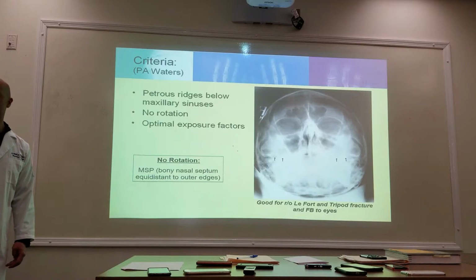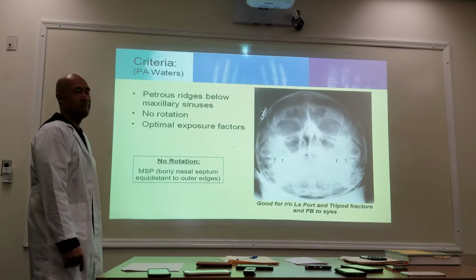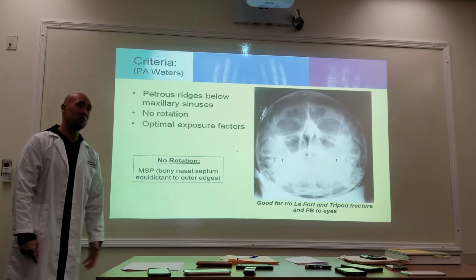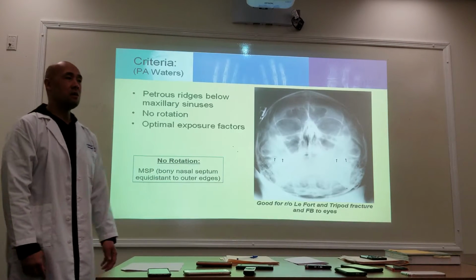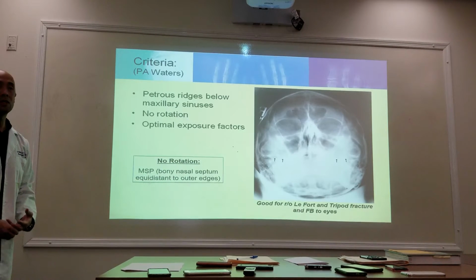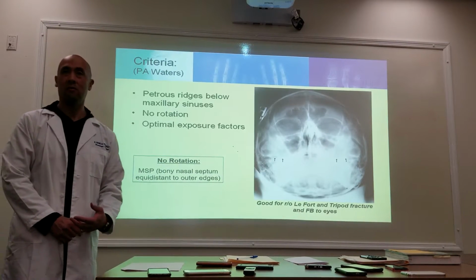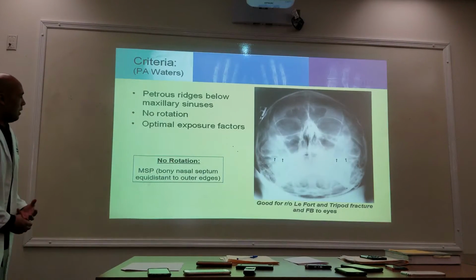What are we telling our patients, by the way, while we're taking these x-rays? Hold your breath? Really? Just hold still, don't move. You can tell them to hold their breath. I think I mentioned that last week. You can probably tell them to hold their breath, because if they're breathing, their head might move. Your call. Do as they do. Whatever they're doing out there in the field, there's no wrong on this. Hold your breath, hold still, or just hold still, don't move is appropriate.